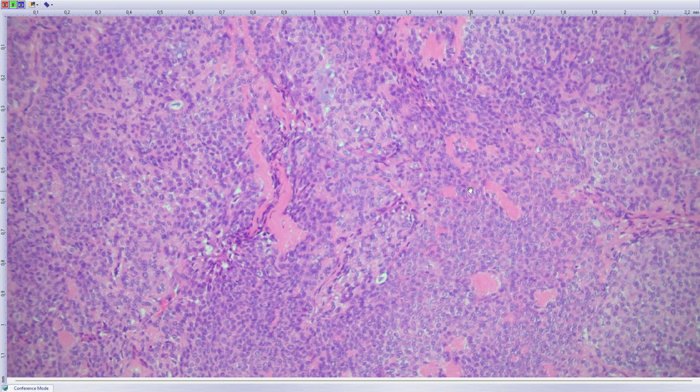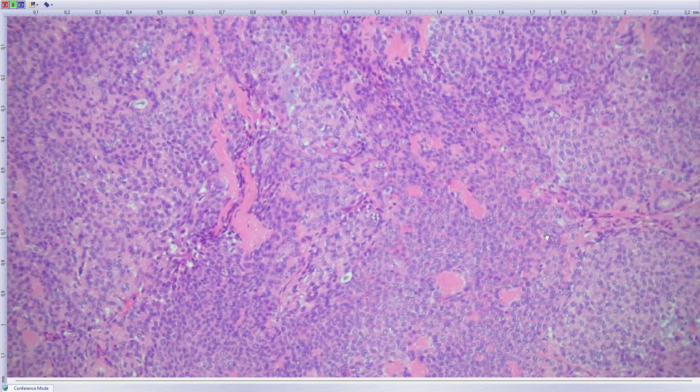With higher magnification, it's the presence of this structure, which we described with Professor Michal many years ago, I would not tell you how many years, as collagenous crystalloids. It's a typical product of myoepithelial cells, mostly in benign tumors, but it has been published also in single cases of myoepithelial carcinomas and elsewhere.